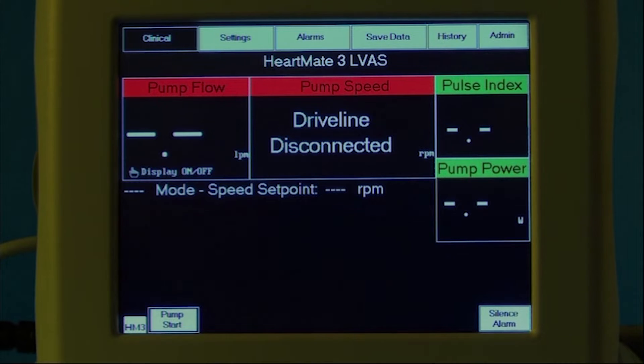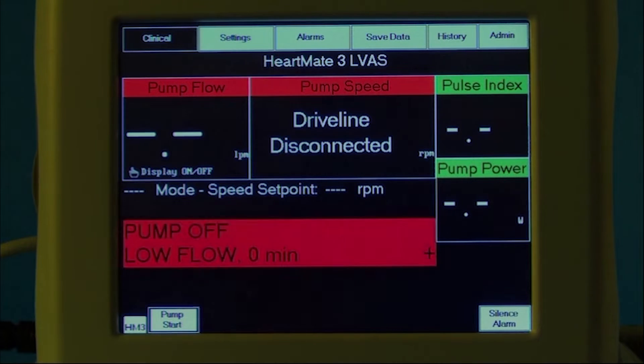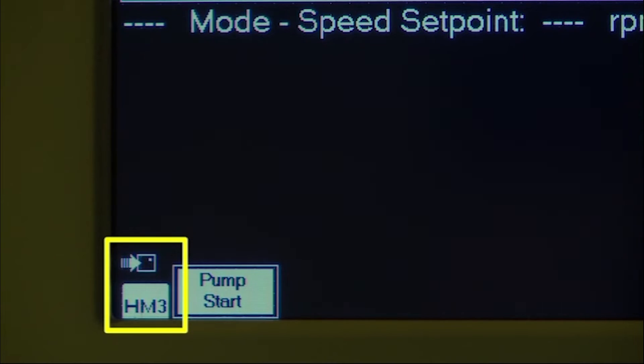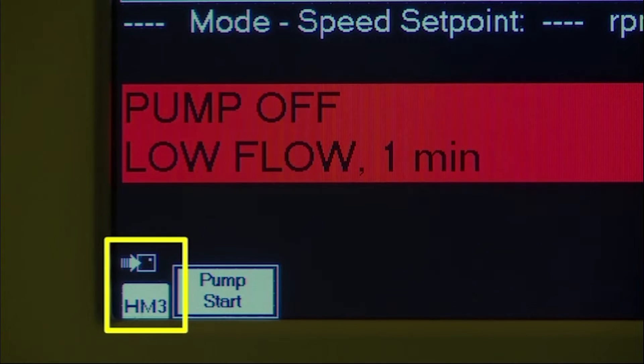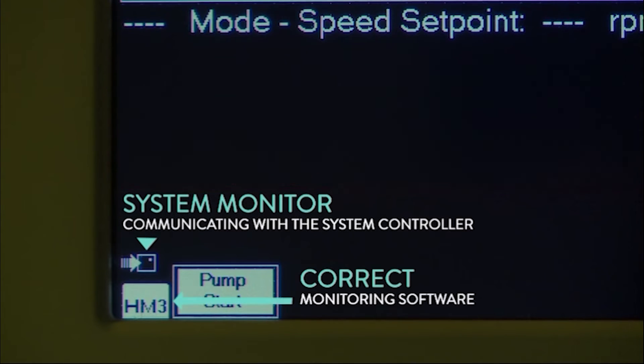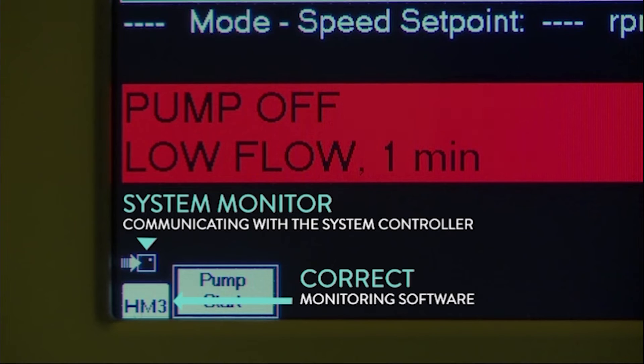The clinical screen will appear on the system monitor. Verify that HM3 and a flashing communication icon are shown in the lower left-hand corner of the system monitor screen, indicating that the system monitor is communicating with the system controller and that the correct monitoring software is running.